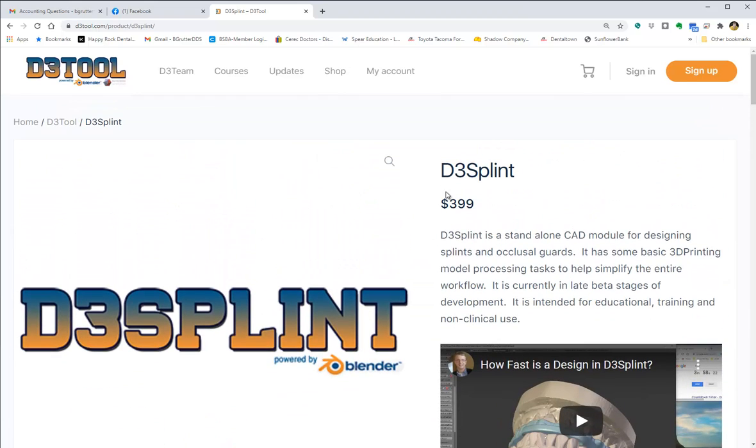When you buy it, you will create an account on the website, and that will allow you to download it. When there is an update, you will need to log back in, so make sure you remember your login credentials, because you will re-download the new updates. Just delete the old version and use the new one. We used to be able to update the software internally, but that comes with a couple caveats, and so Dr. Patrick Moore found that it was just a lot easier if we just downloaded a new update, and that's worked fine.